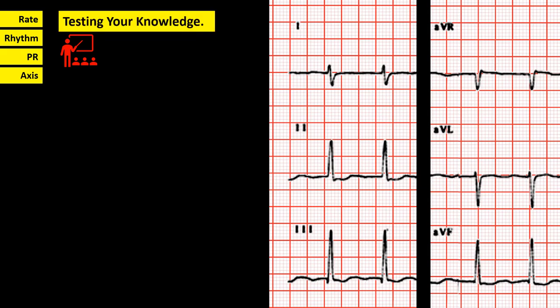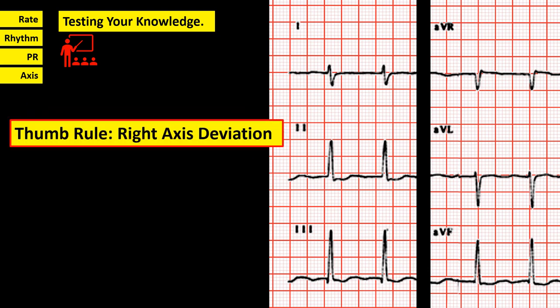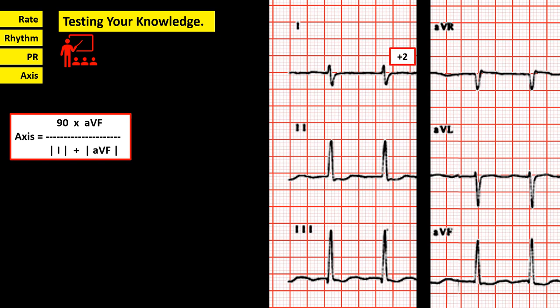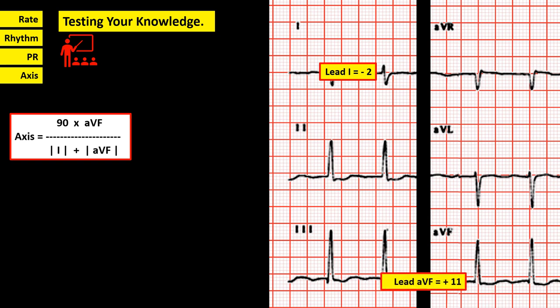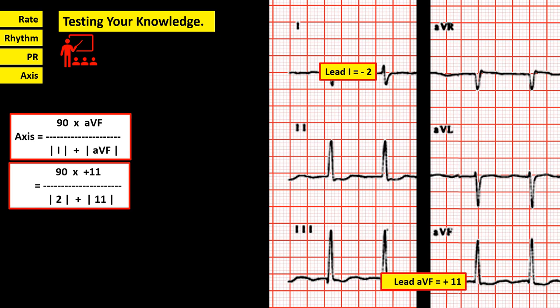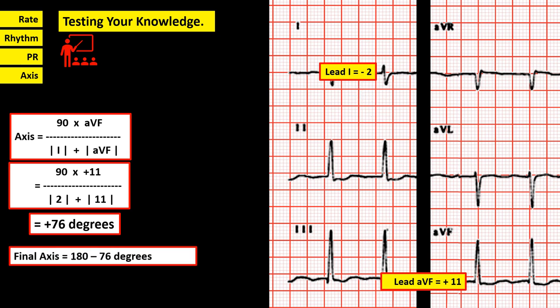Another tracing: by thumb rule, it is right axis deviation because lead 1 is predominantly negative and lead AVF is predominantly positive. Confirming with the formula: in lead 1, there are 2 boxes positive and 4 boxes negative, so the value is negative 2. In lead AVF, 12 positive boxes and 1 negative box, so the value is positive 11. Axis equals 90 times 11, divided by 2 plus 11, giving positive 76 degrees. But since lead 1 is a negative integer, we proceed to the additional step: 180 minus 76 equals positive 104 degrees, which is classified as right axis deviation.